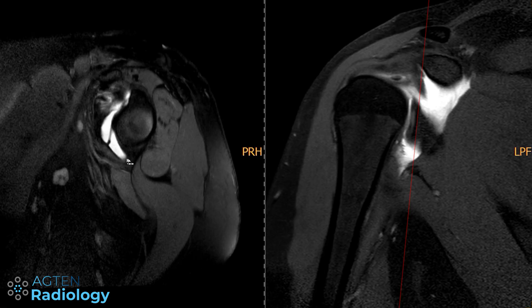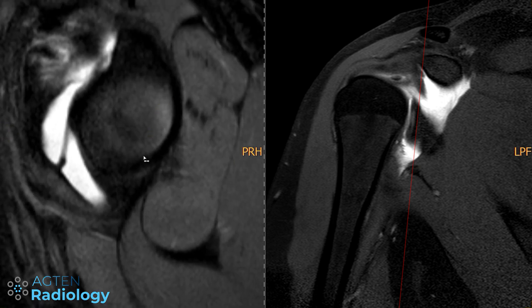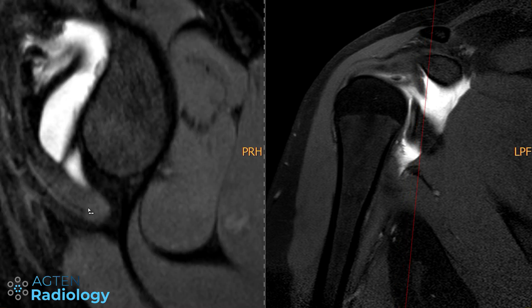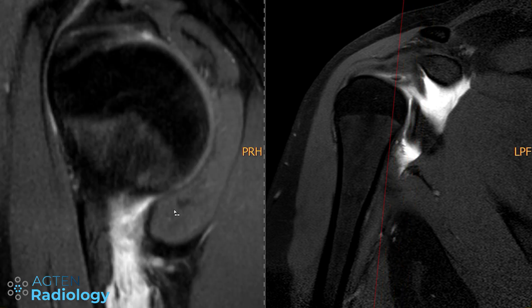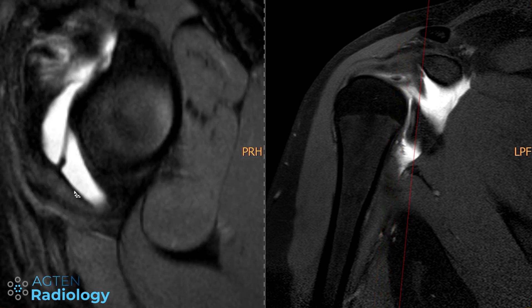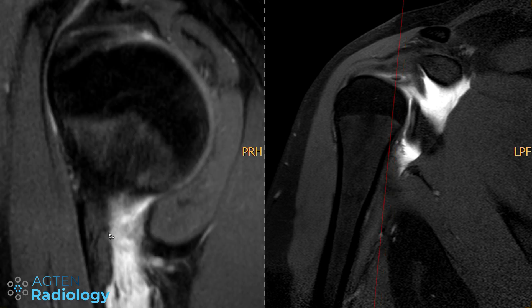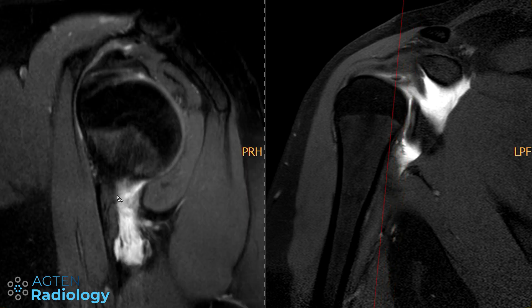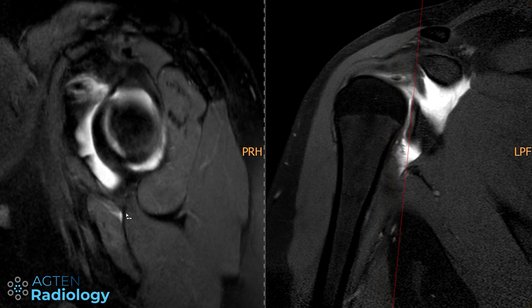Referencing the literature: if you only have an extravasation in the posterior portion of the axillary pouch, it's in nearly all cases an iatrogenic extravasation. You can see here that anteriorly it's fine — no leakage. The leakage is really happening in the posterior portion of the axillary pouch. This is another reason why this is just an iatrogenic extravasation and not a true HAGL lesion, as confirmed by arthroscopy.